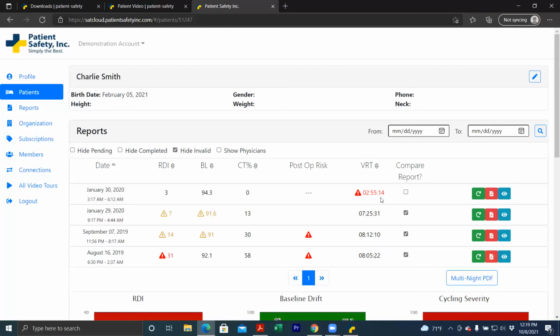These alerts aren't a full report, but they can be a great way to just see a snapshot of how your patients are doing. And if you're seeing a risk alert, then maybe looking into that patient a little bit more, continuing treatment with them is a good option.